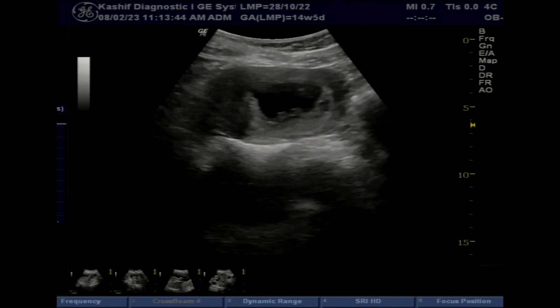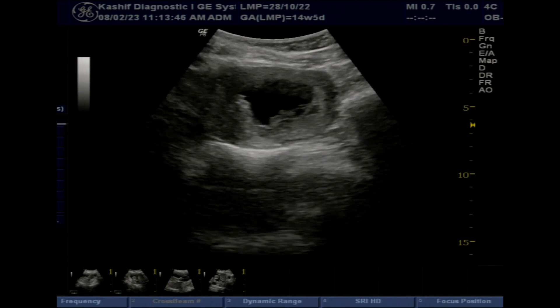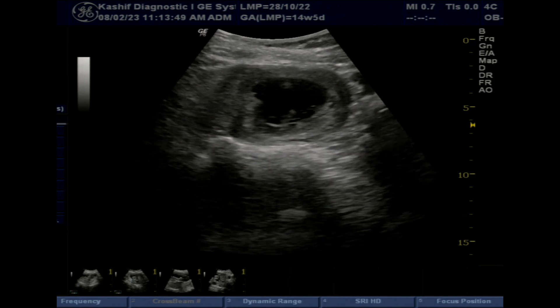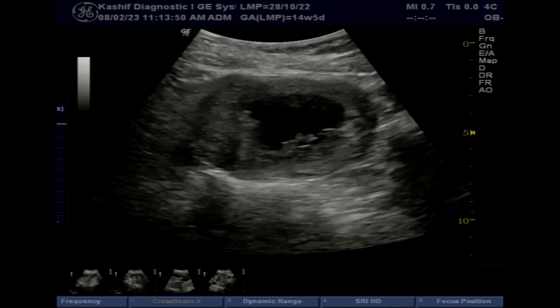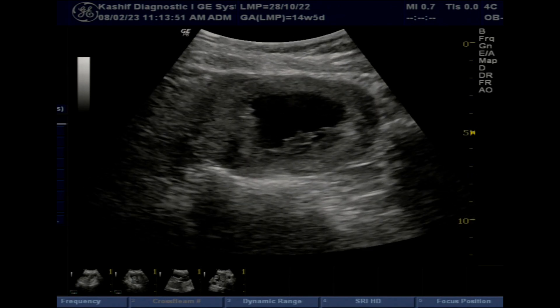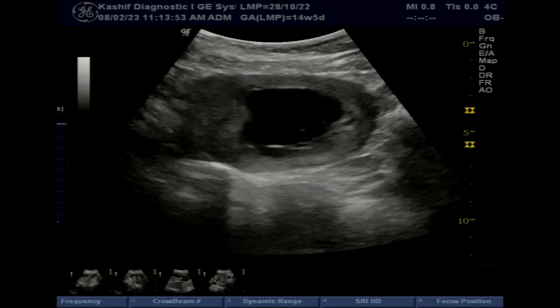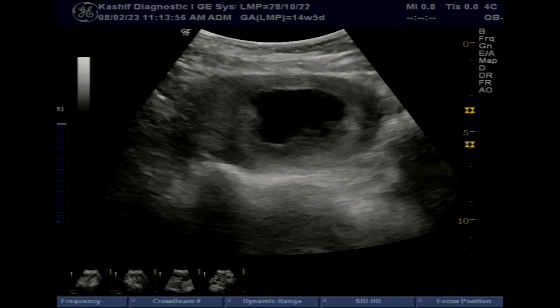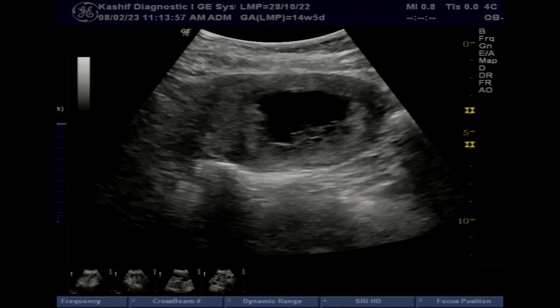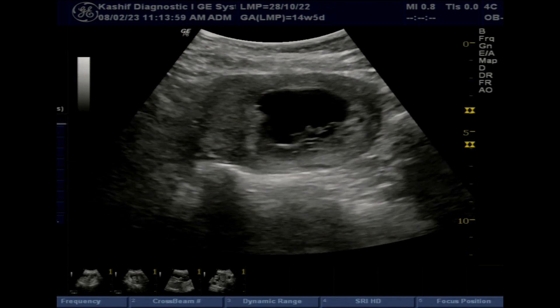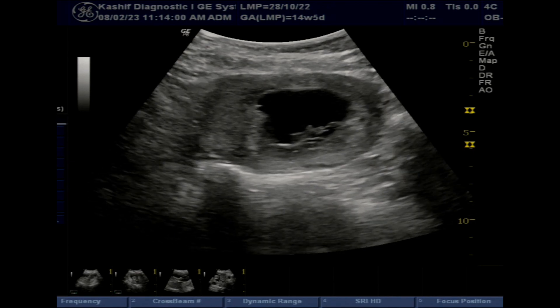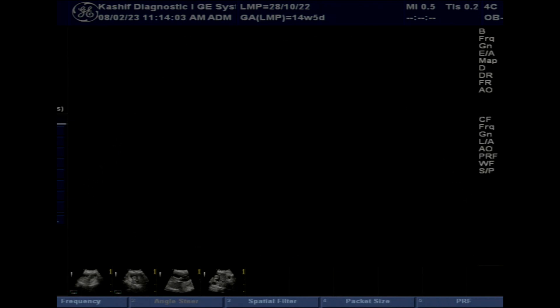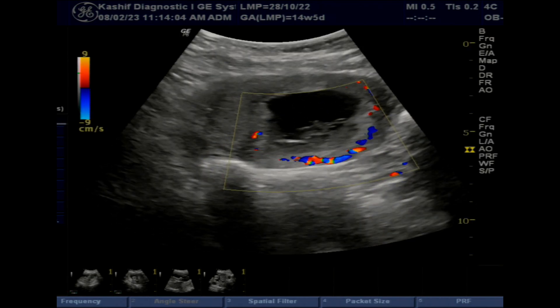A fetal pole is seen in the sac. Gestational age is 10 weeks 6 days. No cardiac activity is seen in the fetal pole. No intra-sac blood flow seen. CRL gestational age is 7 weeks 6 days. This is a case of missed abortion.